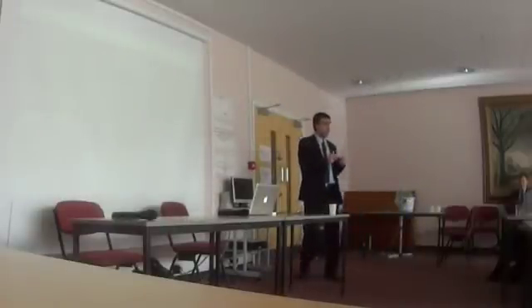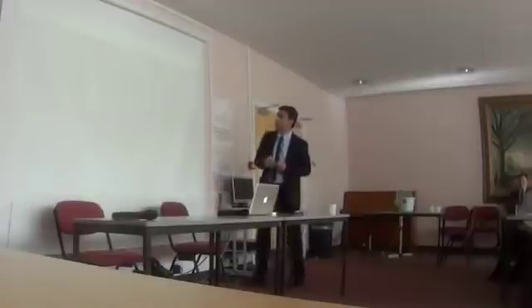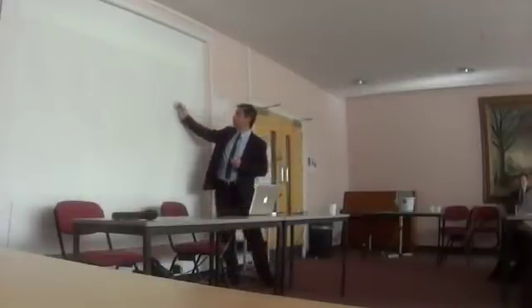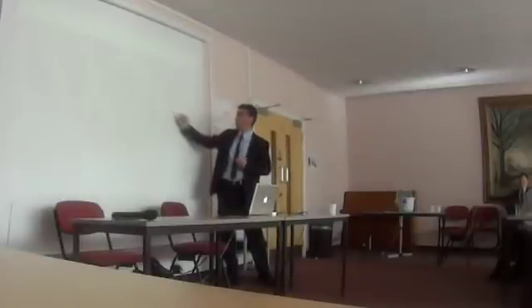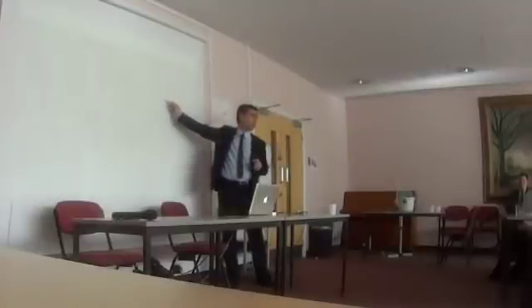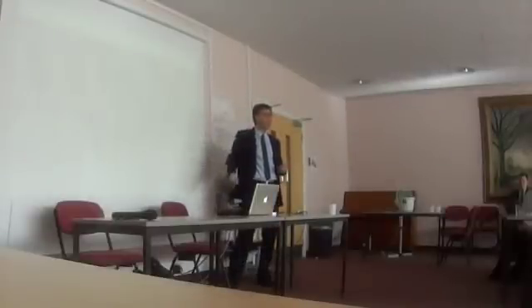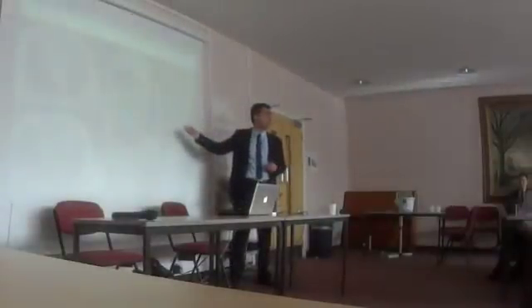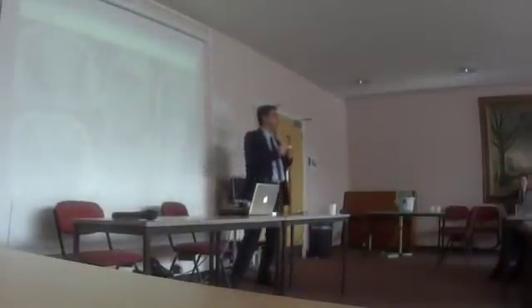So, although it didn't have a scar, another modality we can try is to see how this area, which is thick, behaves. If I show you in these views, we can create boxes within the heart muscle. If you look at these boxes compared to the rest, the rest contracts well, this area doesn't. So this is another view where we look at the echocardiogram, so not only can we see it visually, we can do other tests to look at this. This area, which is thickened, is not functioning.